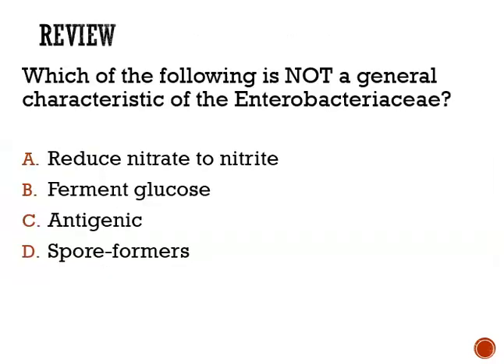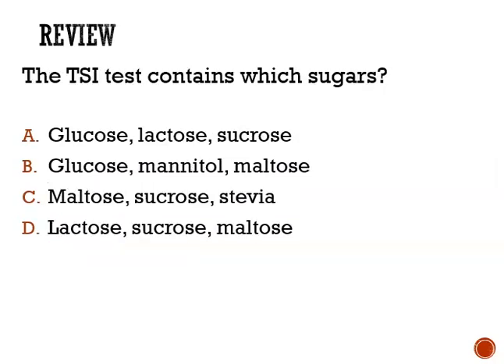Which of the following is not a general characteristic of the Enterobacteriaceae? They are not spore formers. Okay, the TSI test contains which sugars? Glucose, lactose, and sucrose.